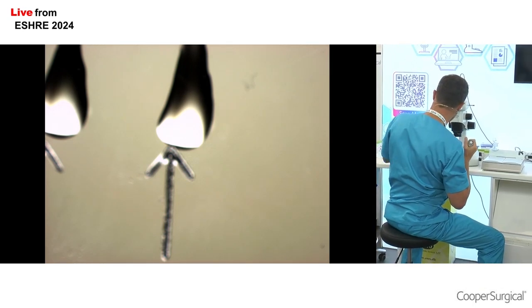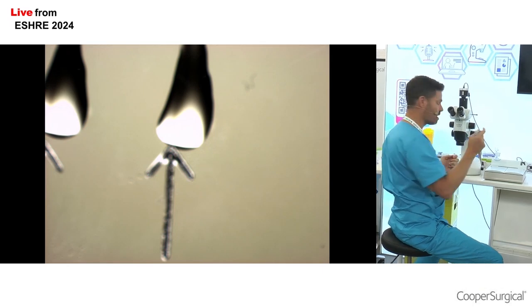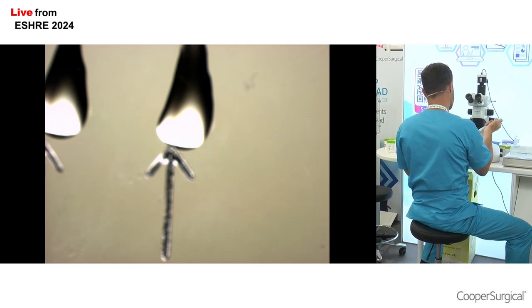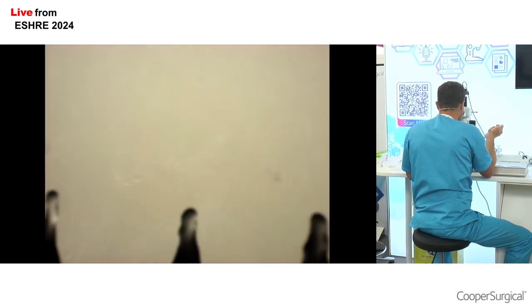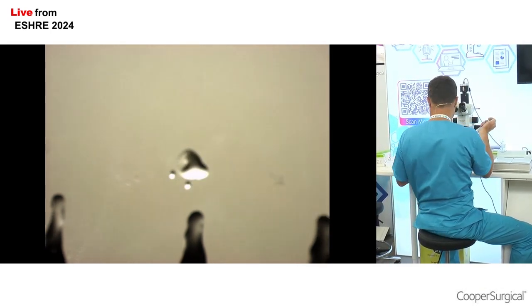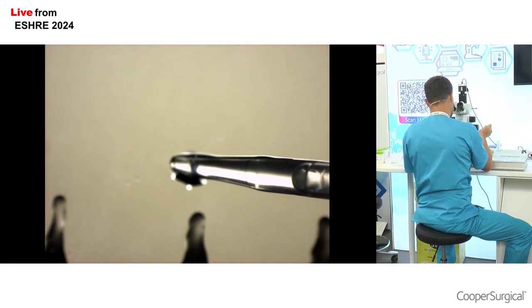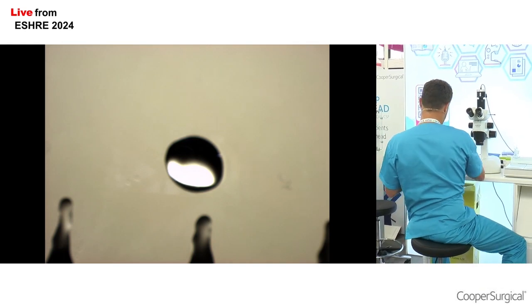Now I'm also going to use normal PVP. And in the center of the dish, like we would normally prepare an ICSI dish, I'm going to place a drop of PVP. The volume here doesn't matter, it's just the volume that you would normally use for a normal ICSI. So we're not actually going to use the PVP like a normal ICSI to immobilize the sperm. The PVP, in this case, is just going to be used to load into our ICSI injection pipette so that we can maintain a good control. Okay, 1 drop of PVP. I still haven't added any sperm to the dish.